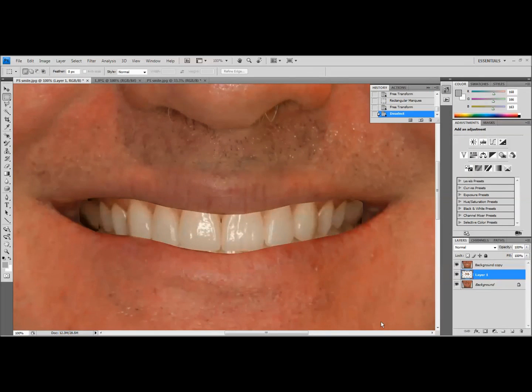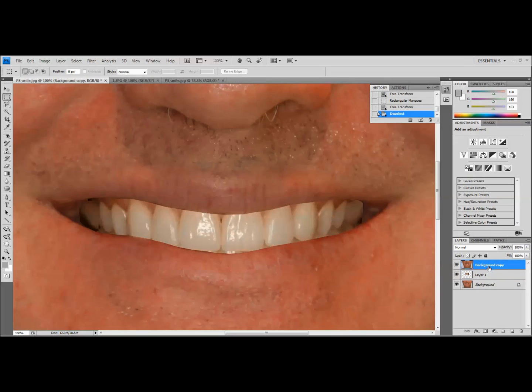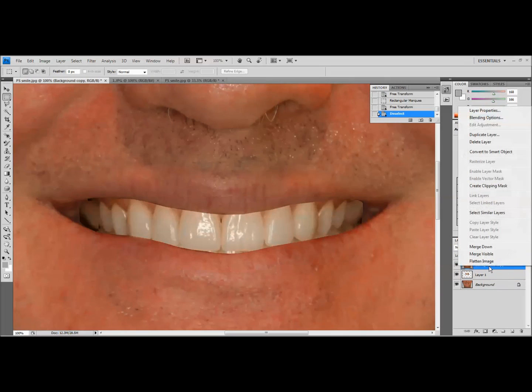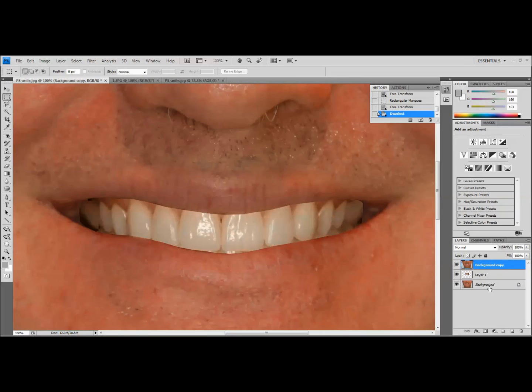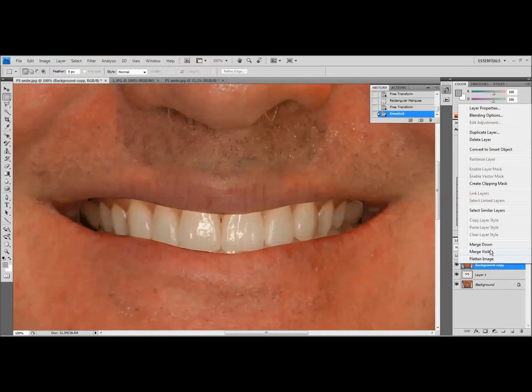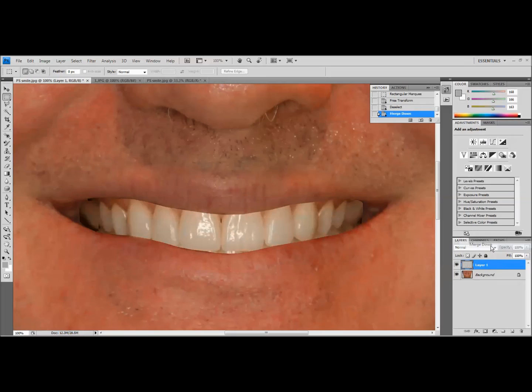So now we've got our simulation more or less done. I'd like to clean this up a little bit more, but one thing I'll do before I start making some of those fine tuning adjustments is I'm going to come up here and I'm going to merge these layers down. So our layer of the smile simulation and the cutout mouth copy, I'm going to merge those two together because now that's going to allow me to make changes and not worry about which layer am I working on. Now it's the same layer.